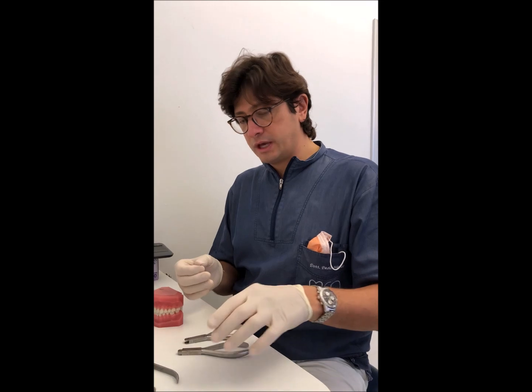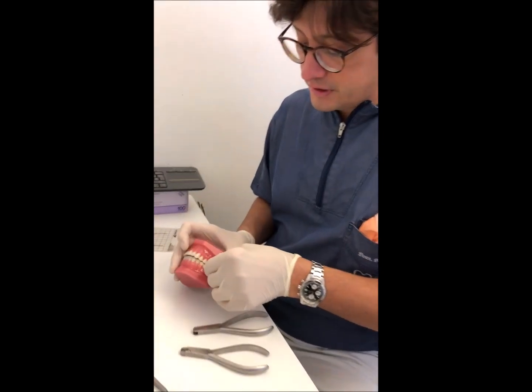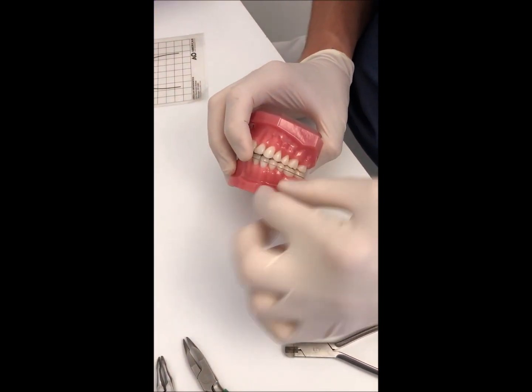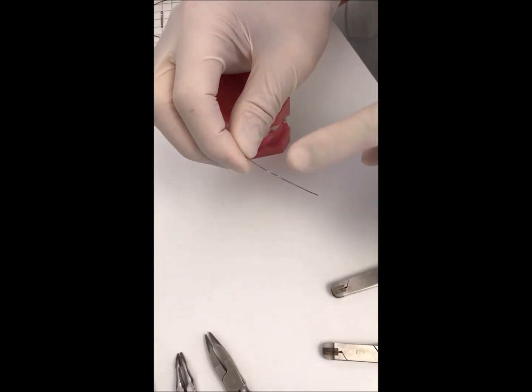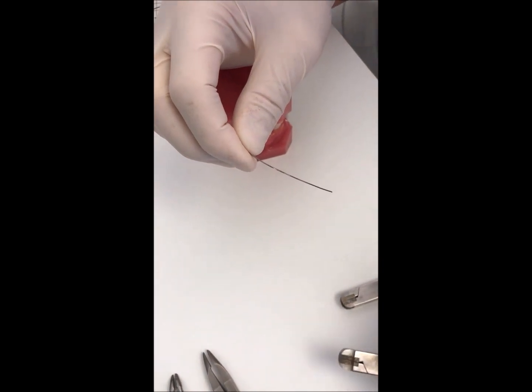In this case, we can work in this way. We have this canine, tooth 33, and we want to place the root lingually. We marked the mesial and distal part of the wire with respect to the bracket, and we can use two systems.